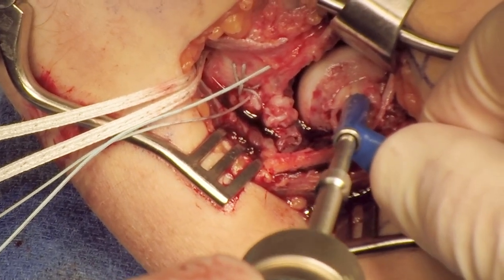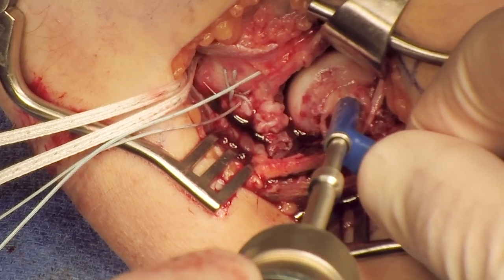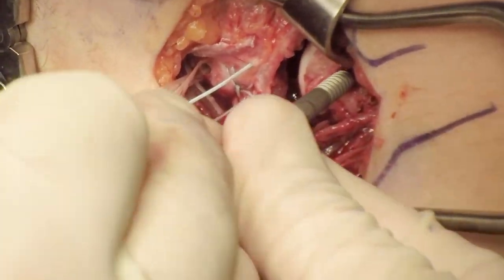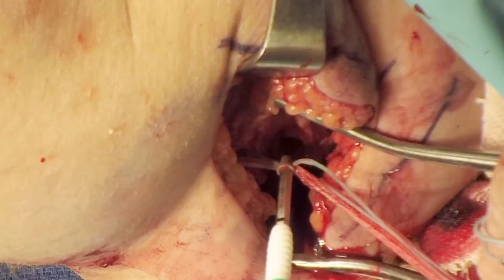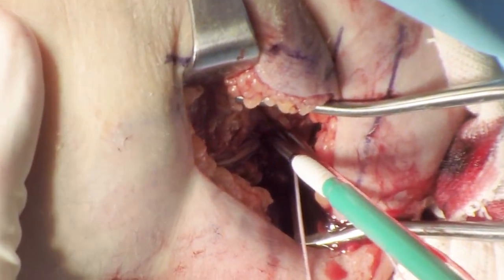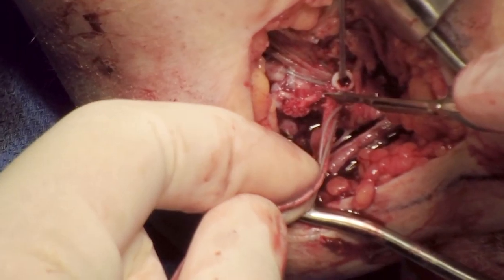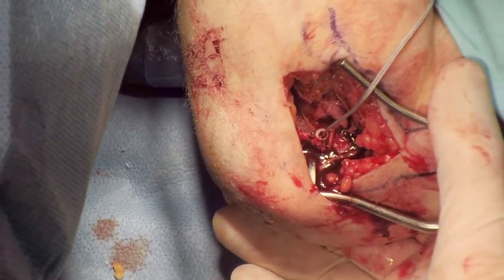The center of rotation is determined visually at the center of the arc of the capitellum. Positioning of this hole can be aided using intraoperative fluoroscopy. If you're going to err, it's better to err a little bit anterior and proximal. The hole is tapped. The fiber tape and the number two FiberWire from the LCL are passed through the eyelet of the anchor. The anchor is placed with the elbow in 90 degrees of flexion, neutral rotation, and a mild valgus stress. The sutures are cut flush with the anchor. The elbow is placed through a full range of motion, demonstrating no instability.